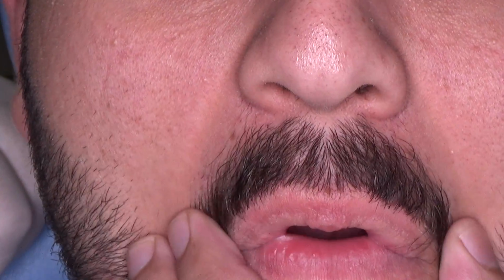Why are you using your finger? Why not a spatula? I'm using my finger because in this case we don't need precise work. We just have to put one small piece of composite to define the new position. This is like a reference point. We are not making an obturation. In this way you can feel, you can shape, it's much faster and easier because the aesthetics doesn't matter in this case.